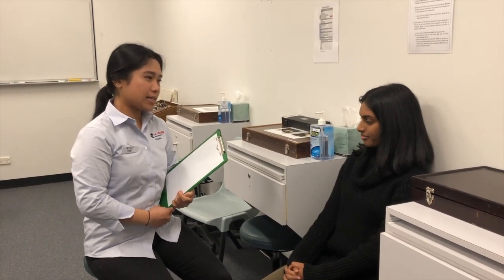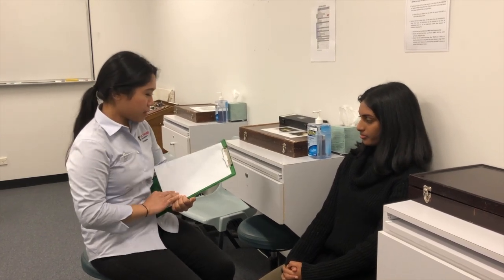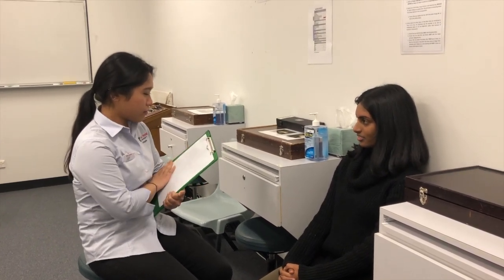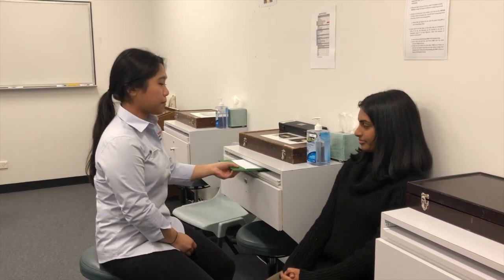Hi Elia, my name's Chanel. I'm going to be your optometrist today. I can see from your referral that you've been referred by Dr. Maryam for decreased vision. So today we're going to be doing a retinoscopy test to see if you need any glasses or corrective lenses.